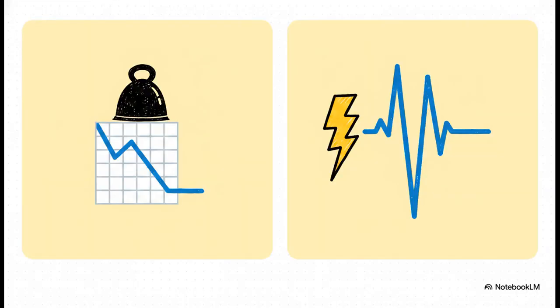And this brilliantly illustrates the crucial visual difference when you're examining T-wave inversions. See, when a heart has ventricular hypertrophy, it causes these repolarization abnormalities. Just look at that strain pattern on the left. It's a slow, gentle, almost sloping curve. Contrast that with the ischemic T-wave inversions on the right, which are sharp, pointy, and deeply symmetrical. Knowing this visual difference is absolutely crucial. It helps you separate a chronic, benign strain pattern from a really dangerous, active ischemic event.